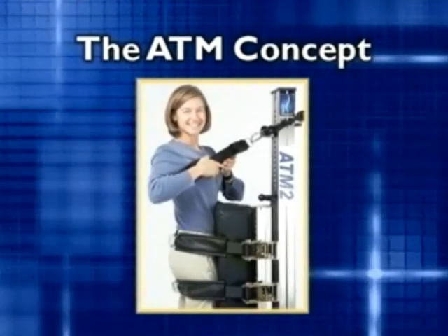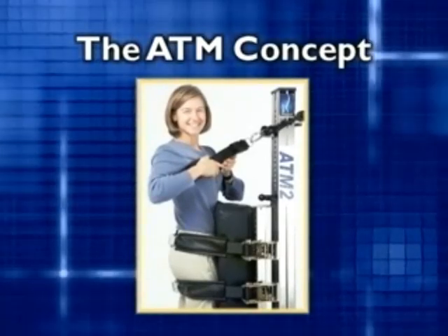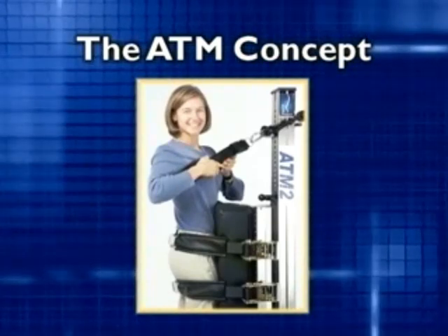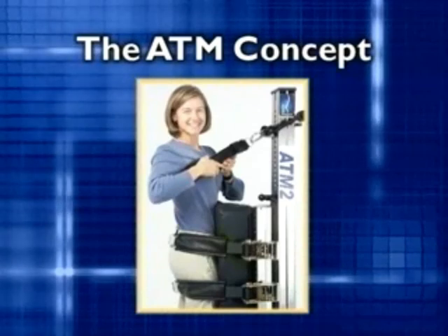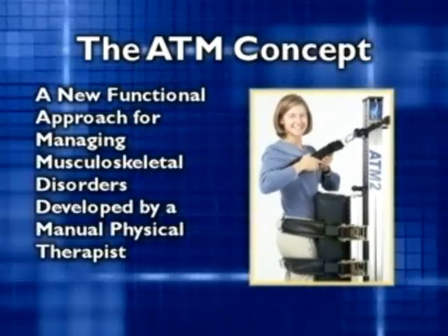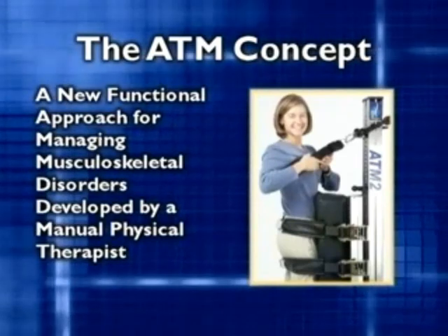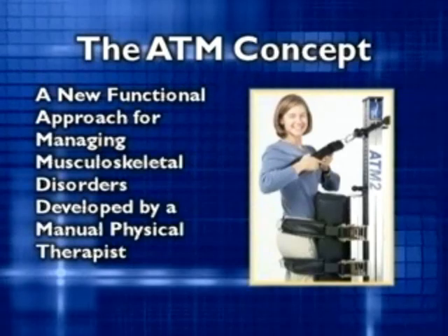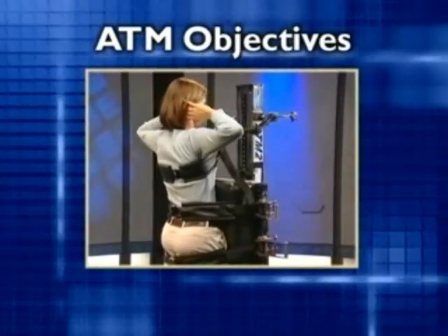The ATM2 provides certified clinicians with a straightforward and effective integrated passive and active approach to treat musculoskeletal disorders. This presentation discusses the Active Therapeutic Movements Concept, or ATM for short, and how to apply it using the ATM2 clinical device. The ATM concept has three main objectives.